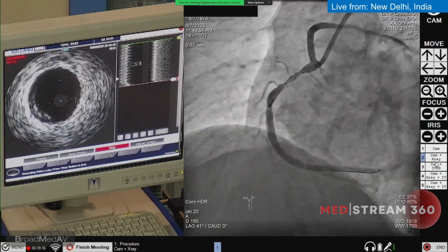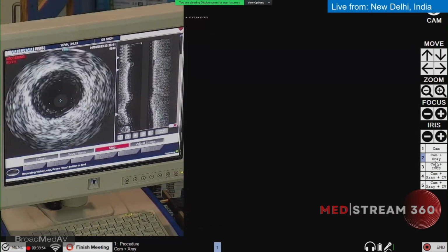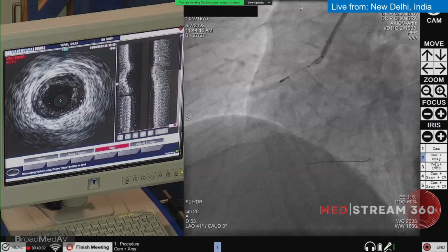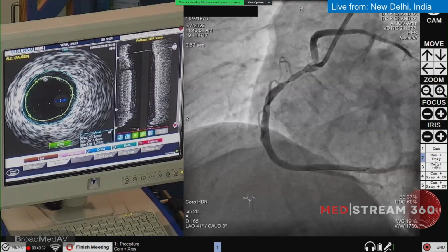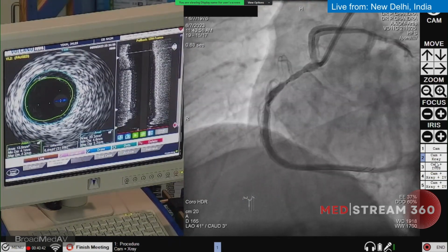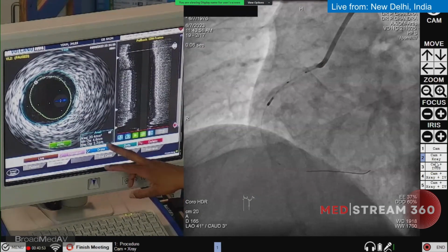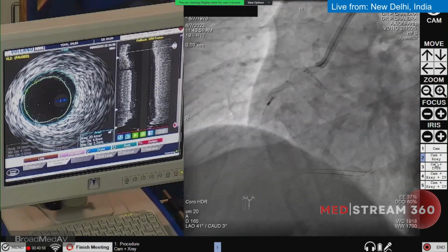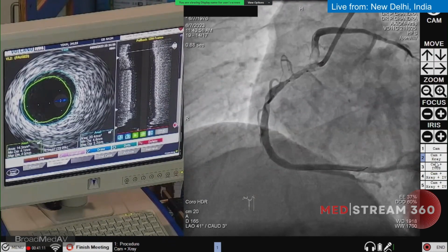So here I am at the distal part. I'm pulling back. So this should be the distal landing zone, I think. Yeah, this is the distal landing zone. This is the tightest part of the lesion. So distally how much is it? Should we take a 4 or a 4.5? That is the question. Show me the fluoro image. So this is about 18, or 19, whatever, because the distal plaque is not to be considered in this. How much is the size? 4.5. So do you have a 4.5 by 18? Otherwise we can take a 4 and go up to 4.5 with another balloon.